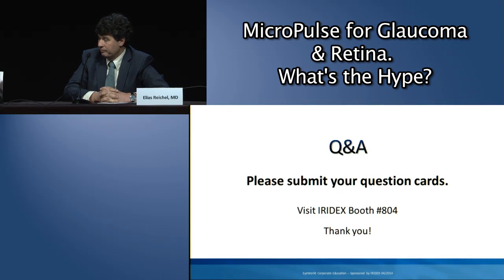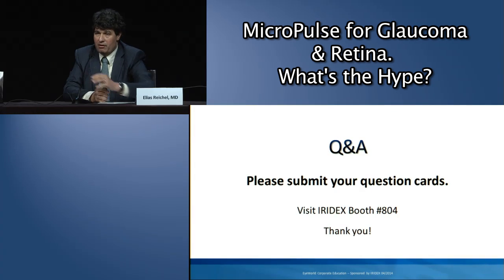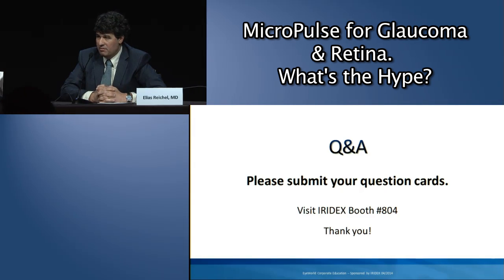And can you comment on microperimetry results? Well, the microperimetry results are interesting. I think it's hard to look at microperimetry results very critically in diabetic eyes because they're reduced anyway. If you look at one of the studies in the handout, retinal sensitivity dropped 6 months after treatment. So there is a slight decrease.